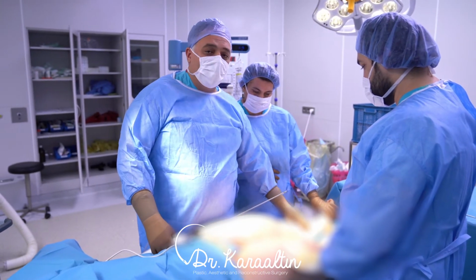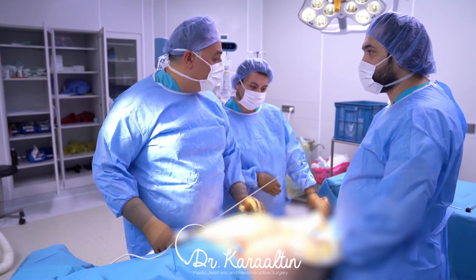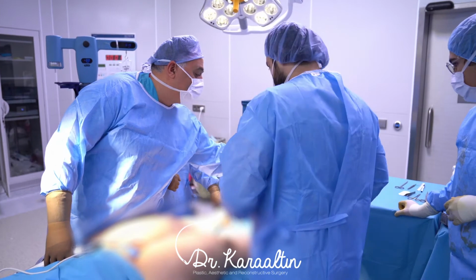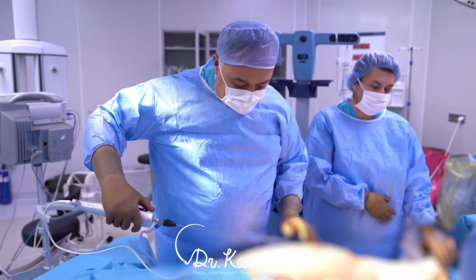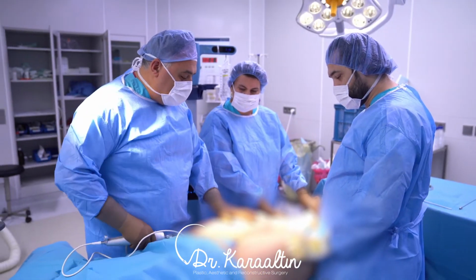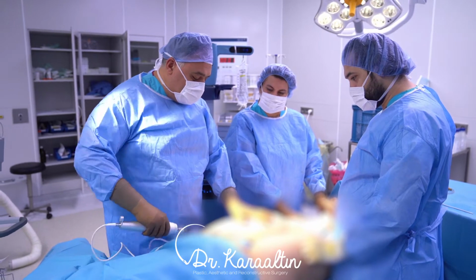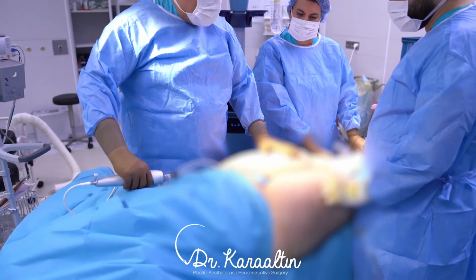Below the knee, you can go very aggressive, but please use very thin cannulas, not exceeding 3 millimeters. I think we have one here. We can show it to the audience. So that's a thin cannula that we can use below the knee. So let's start. Here's a deep plane that we have to go inside, about 2 to 3 centimeters deep, and then you have to be very, very careful and meticulous. So there's a boundary between how much we have to do and how much we can do.